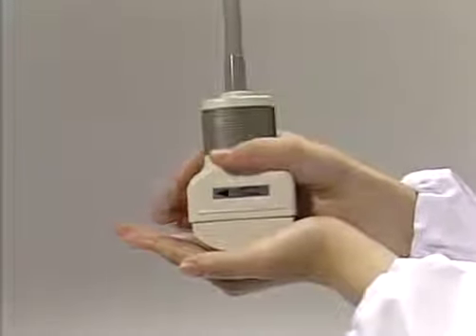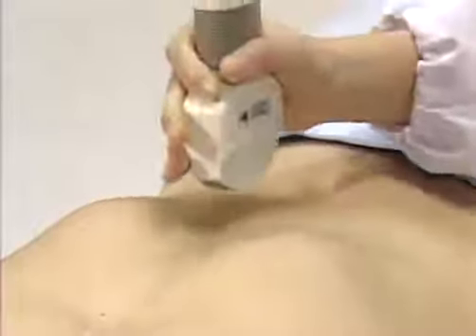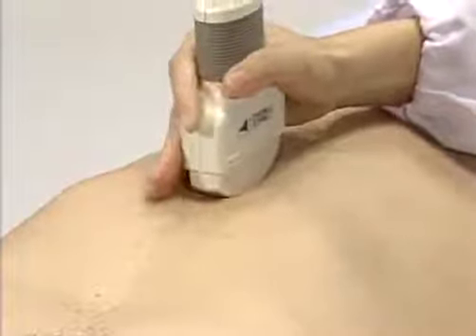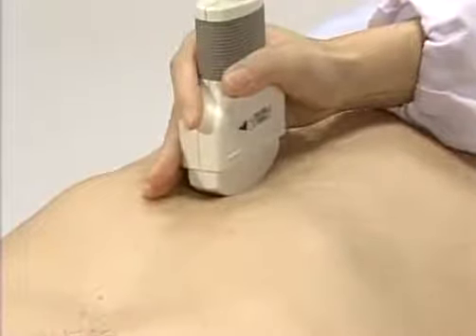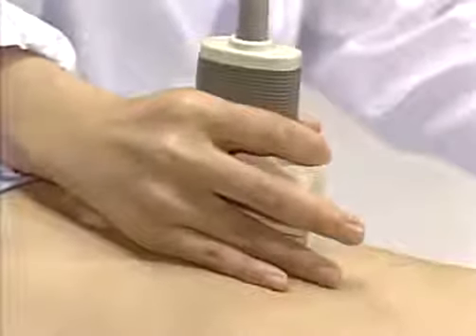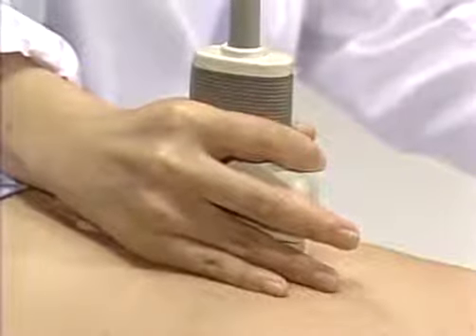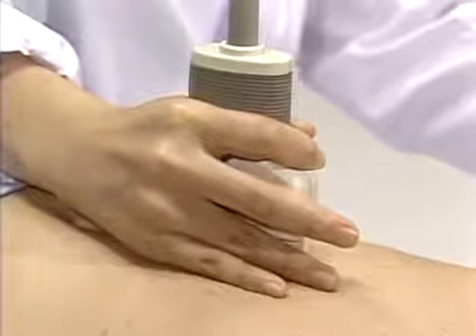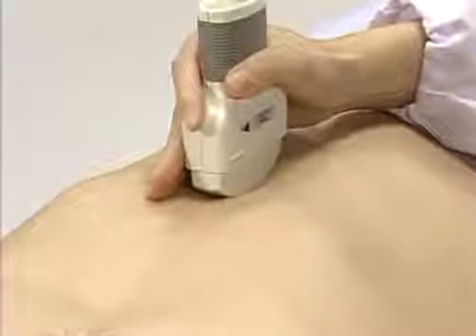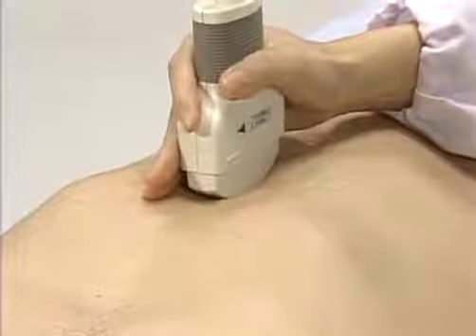The sonographer holds the probe with her right hand, places it in close contact with the patient's skin, then starts the examination. Hold the probe firmly with your thumb, forefinger, and middle finger. Place the ring finger and the little finger on the patient's skin to support the probe. Be sure to hold the probe firmly, as if it were part of your hand.